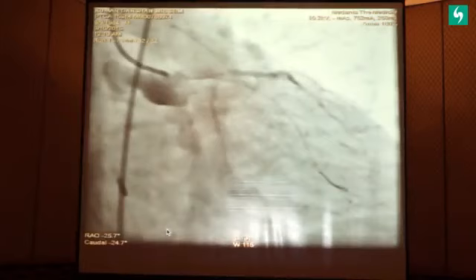So with that, I put in a guiding catheter and just crossed this circumflex, and the flow came back. Fortunately, the massage wasn't required, the pressures came up. But it was extremely difficult to get the wire across the LAD. And every time I attempted to get the wire across the LAD, the left main would occlude.